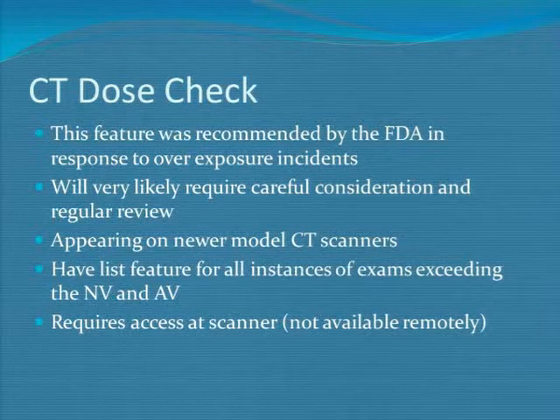And so we have told them that they need to first put in their ID number, their worker ID number. If you don't have 50 or 60 technologists, initials might work. Some of them might actually be able to track the login, but everybody logs in as emergency in our place, so that didn't work for us. And there are people who actually have the same 3 initials, so that wasn't going to work for us either. So we went with ID.